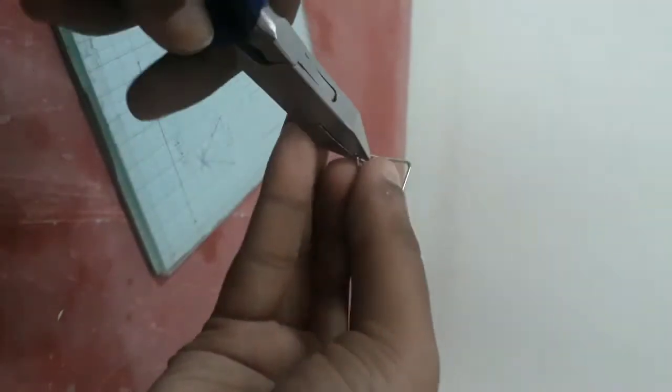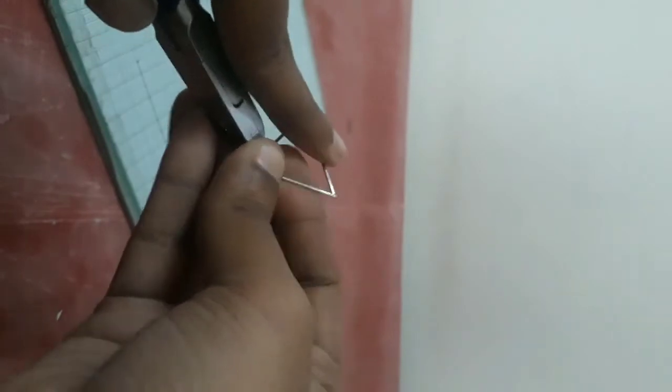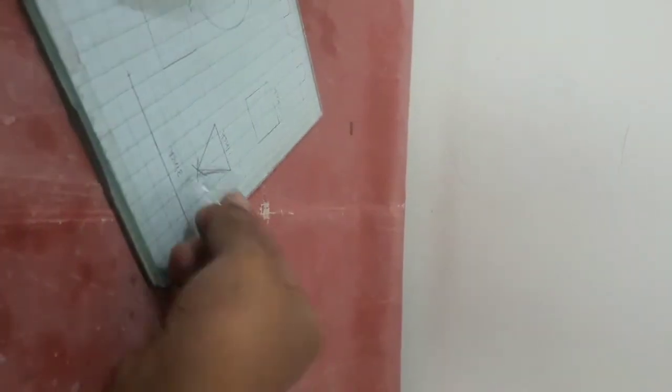If we cut the excess wire, we can place it. When you place it, you can adjust the fit. If we cut the excess wire, it will be better.